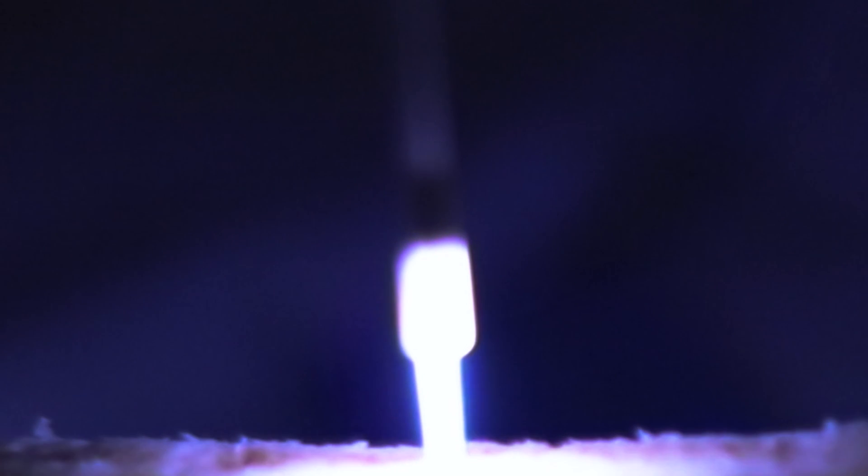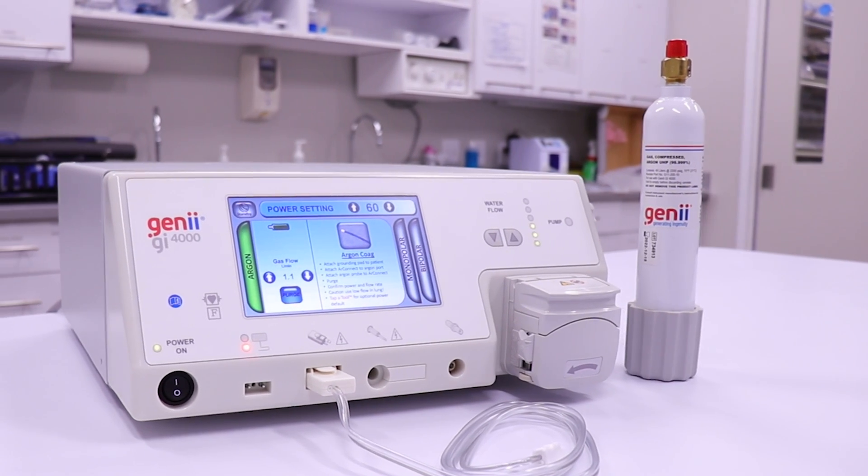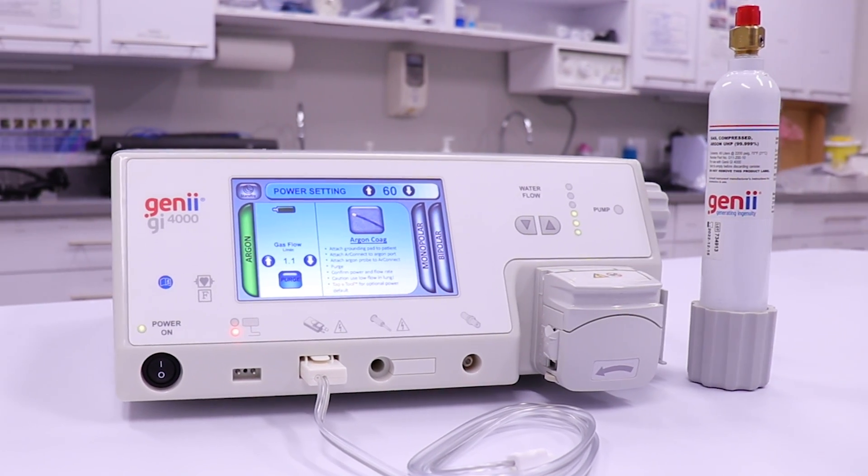Hello, thanks for tuning in. In this video, we will be discussing the argon gas system with the GI-4000 ESU, more specifically, its proper setup and use.